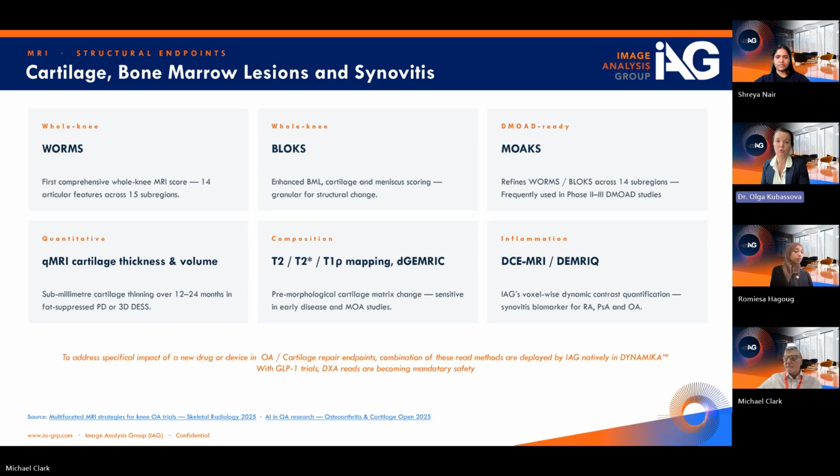Those are related to cartilage thickness and volume, cartilage quality, and contrast of the synovitis. So changes in contrast of bone, changes in synovitis, of bone marrow lesions through dynamic contrast enhanced MRI. So these are processed generally with automation. When you're looking at synovitis and changes in synovitis, this is for inflammatory changes within a knee joint, it's nearly impossible to place a region of interest that will be accurate enough to depict the volume of synovitis.